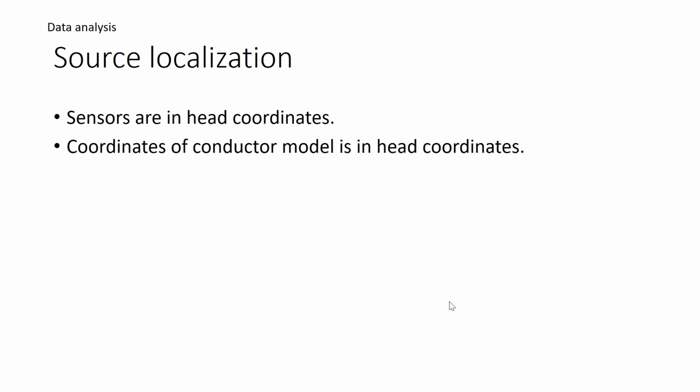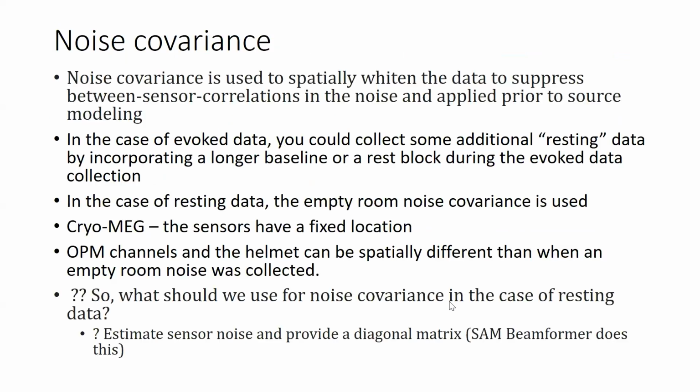Yeah, and I just have one last point in terms of source localization. There's been lots of talk about that, but the one thing I'm wrestling with is how to compute, for SSP, ideally some kind of noise data file to construct your projectors.